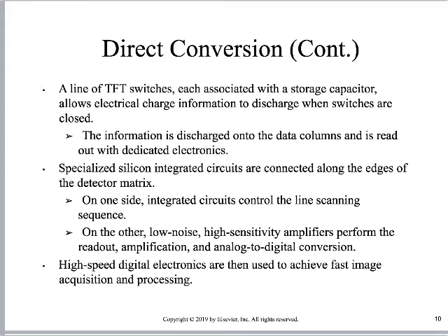That's how we're going to read this thing out. We're going to discharge those capacitors. Now, if you're wondering what in the world is a capacitor, just think, bro, don't tase me. That's what a capacitor is. It's a taser, right? A taser is a very large capacitor. It's the reason why if you're ever in a junkyard as a kid like I was, you shouldn't open up old television sets. Not only are they full of lead and crap, they have gigantic capacitors inside of them that would knock you across the junkyard, right?